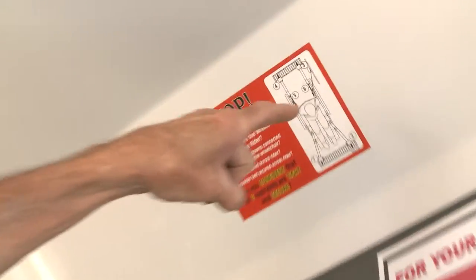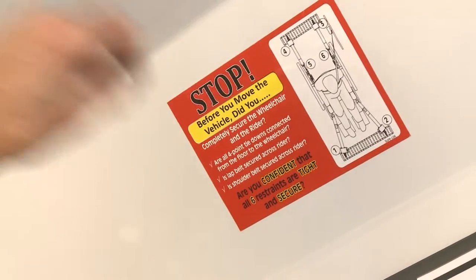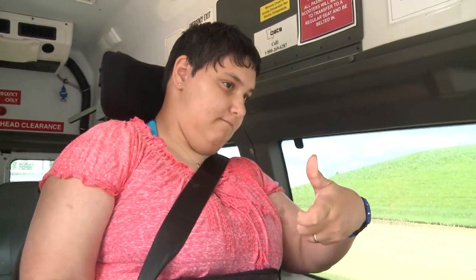We're going to check our VCAL: one, two, three, four mobility aid securements; five, six occupant restraints — correctly secured. Are we ready to go, Ashley? Good, thank you.